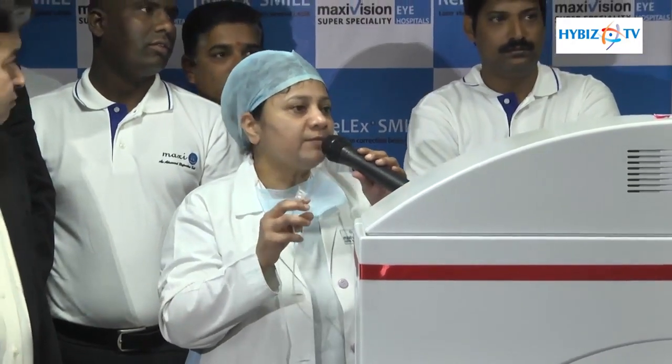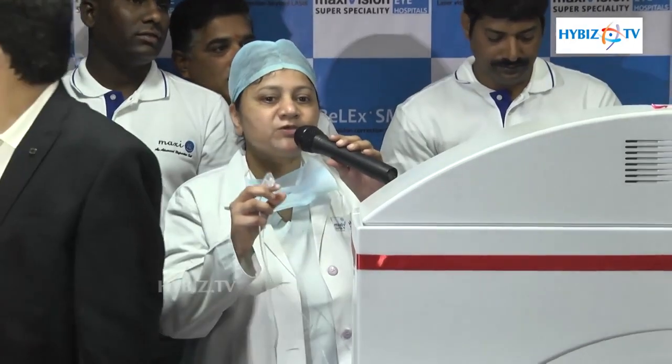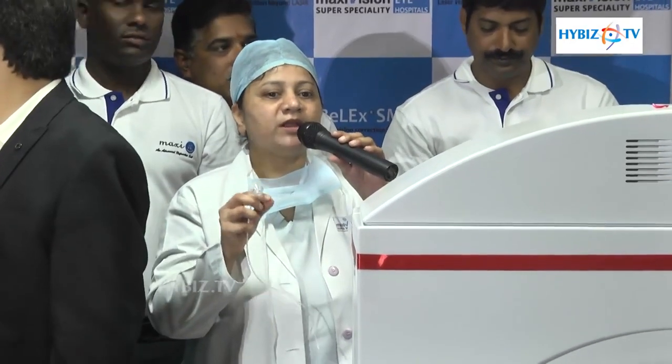It is a very simple surgery and the surgery is over. The recovery of the patient is very fast because it is very small and very fast.